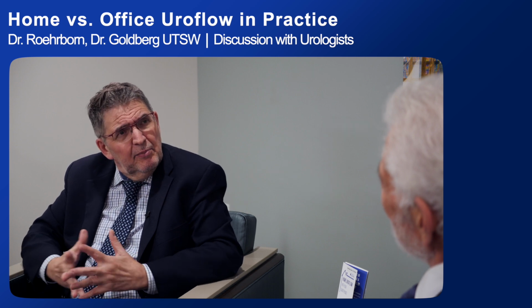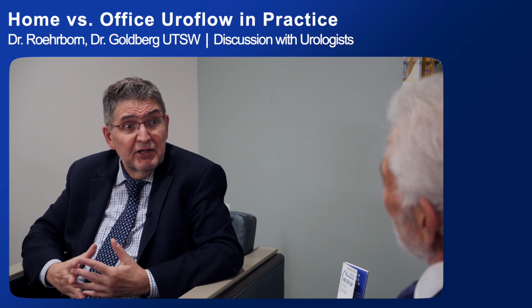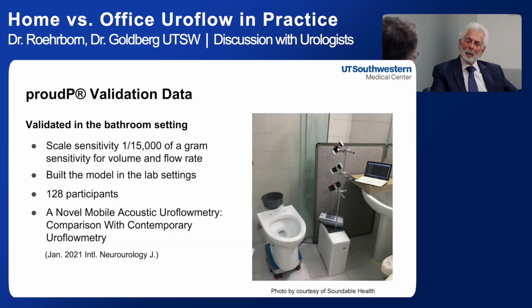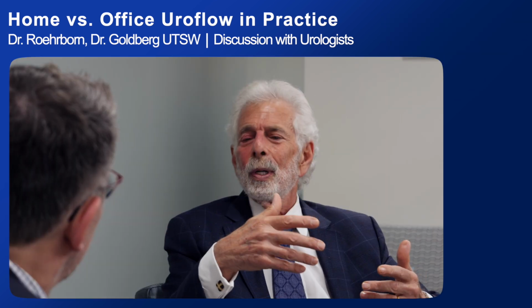So that sounds interesting and kind of wild. So what did the company do to validate this, if you will, to make sure this really measures what we are used to? It comes in the same ballpark. Well, they did a couple of things. First thing they had to validate was, is there a distance and can it record at a certain level and distance? And so they actually reproduced sounds having 20, 30 iPhones set up on stands and measured and got consistent results. And not only flow, but volume. Consistency with their volumes, almost close to a straight correlation.